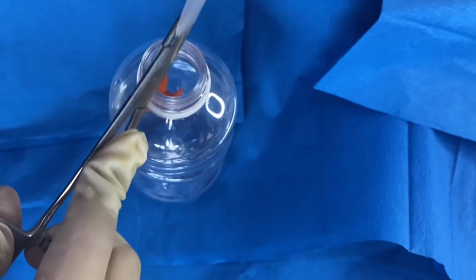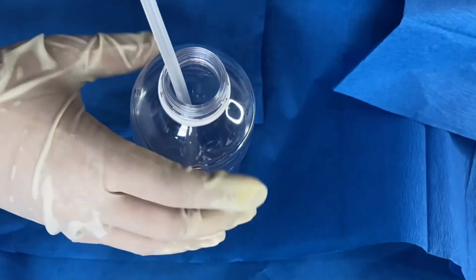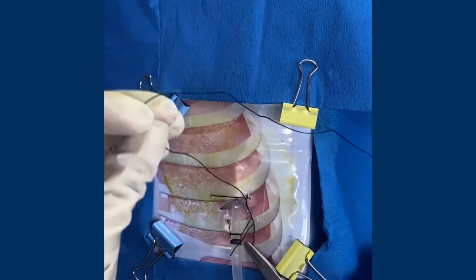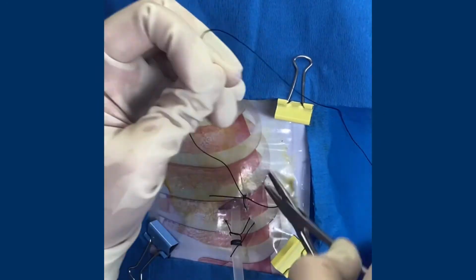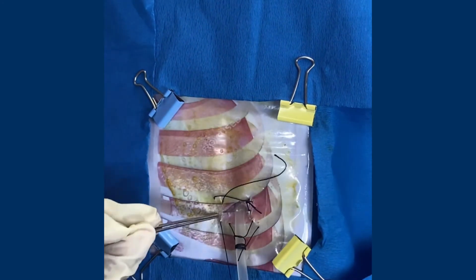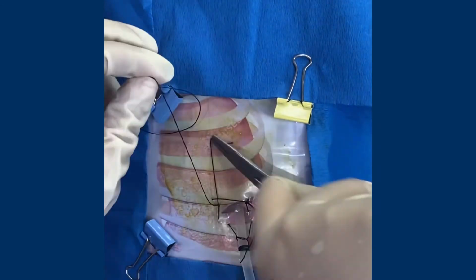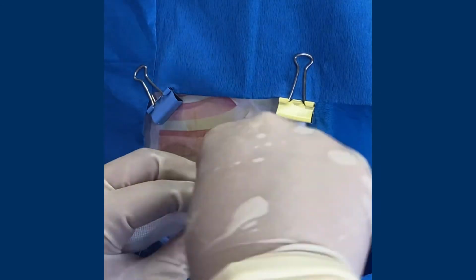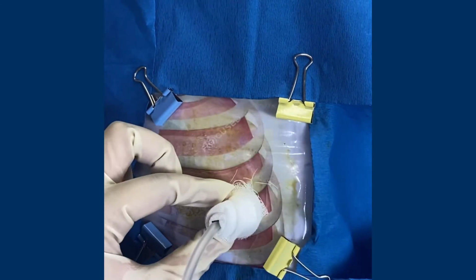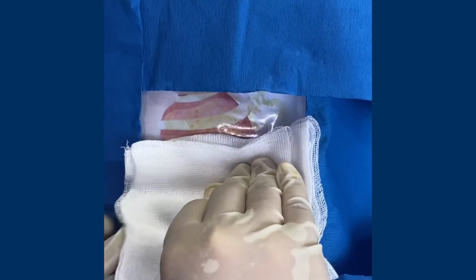Before unclamping the distal end of the tube, connect the tube to the underwater sealed chest drainage system. Make additional stitches for skin closure. Dress the tube with a vaselinized gauze around it and push up against the chest to ensure no air leak. Cover the tube side with 4x4 sterile gauze with a slit.